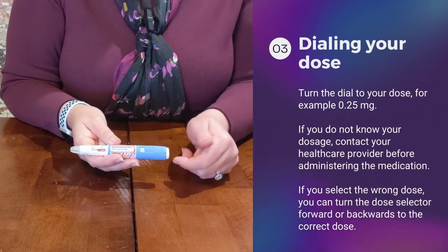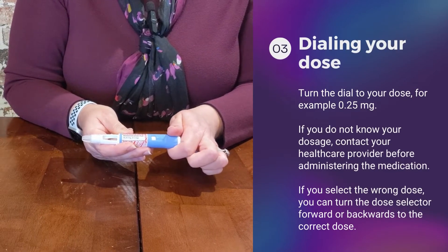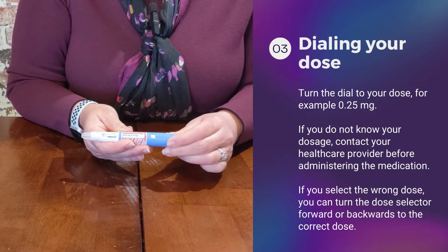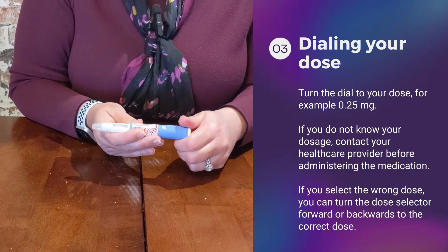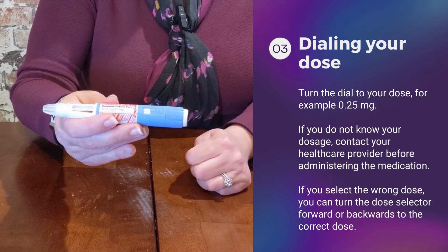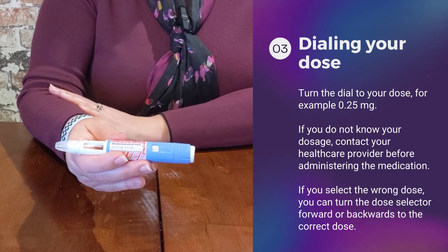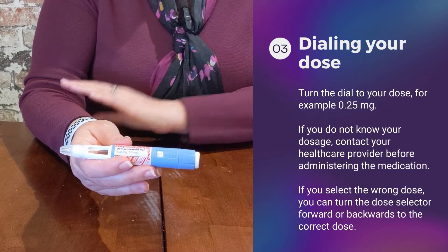Now we're going to talk about dialing your dose. This blue area down here — you're going to dial to your dose. We'll say you're starting at 0.25 milligrams. Once you've confirmed that the dose is correct, you are ready to give your injection.